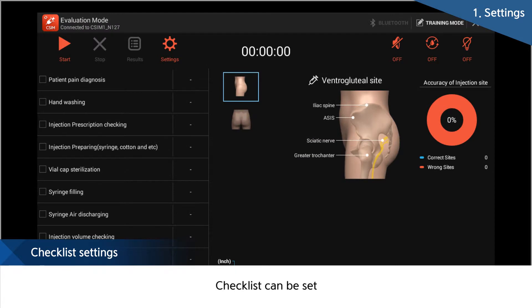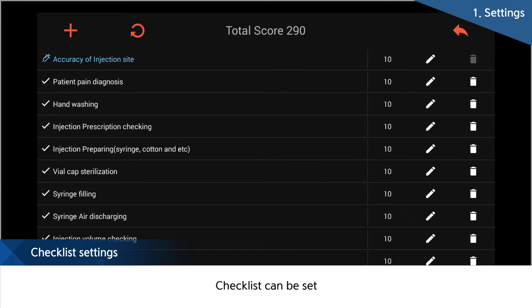Prior to education, the checklist can be prepared in settings. Also, the learning procedure which is needed during entire training can be set so that students' understanding of education improves.